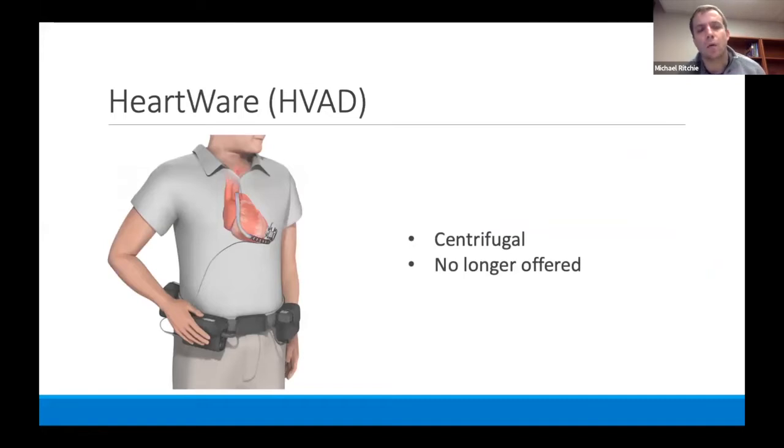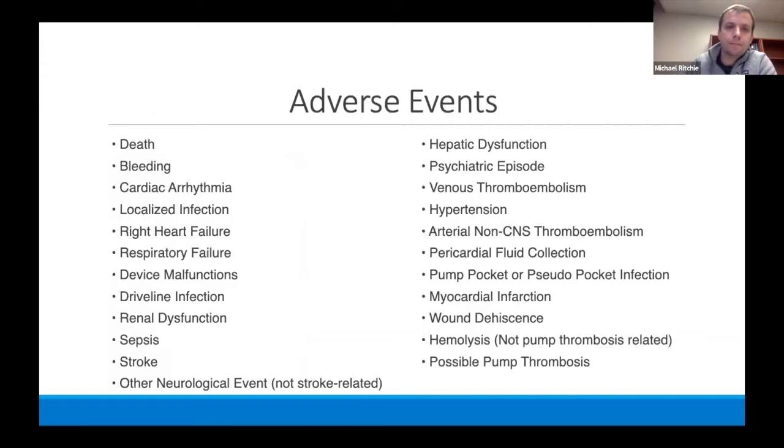HeartWare or HVAD was used for a while and had some good outcomes, but they were getting a lot of clotting issues, pump thrombosis, a lot of times where the motor wouldn't turn back on. And so they've actually stopped offering HVADs being newly implanted, but there are patients out there that currently have it.